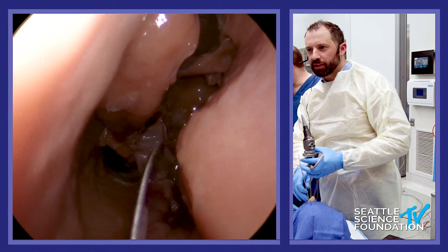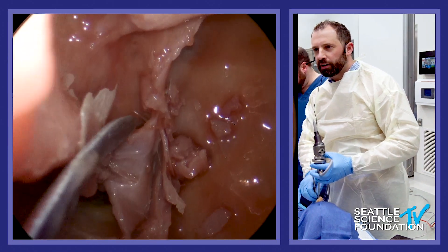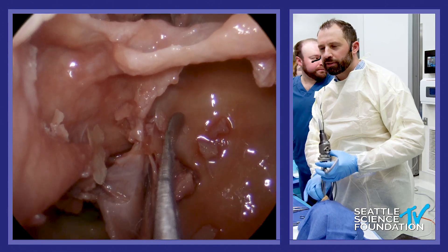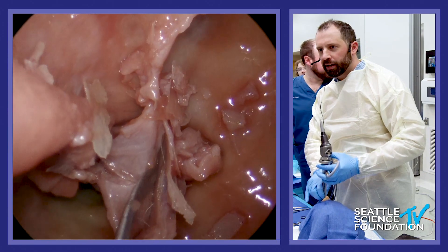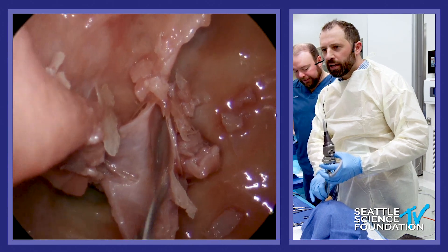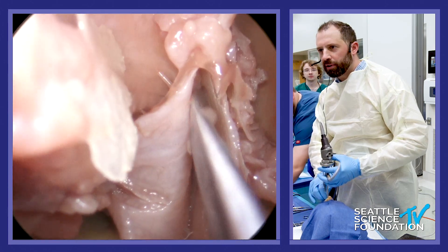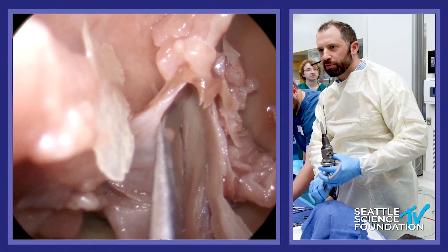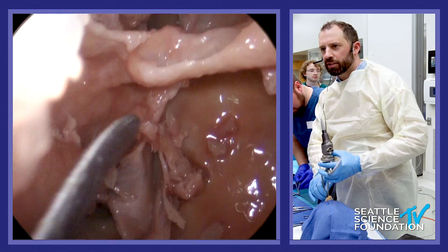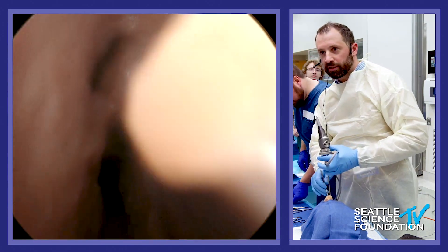So principles of SPA ligation — we'll use this side to demonstrate the relevant anatomy that we're interested in, and then we can come to the opposite side and do the dissection. The area of interest for the SPA ligation is going to be where the sphenopalatine artery comes out from the lateral nasal wall, posteriorly to the maxillary sinus. Where a medial maxillectomy has already been done, we can leverage this space to understand the anatomic relationships. The first bone that comes to mind is the vertical process of the palatine bone, which will take us to the crista ethmoidalis, into the area where the SPA is going to come into the posterior lateral nasal cavity.